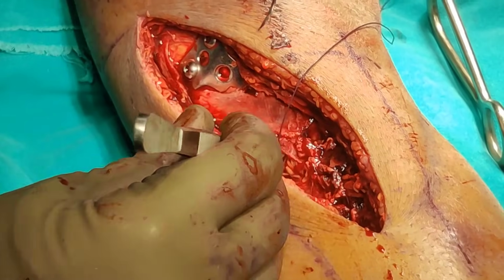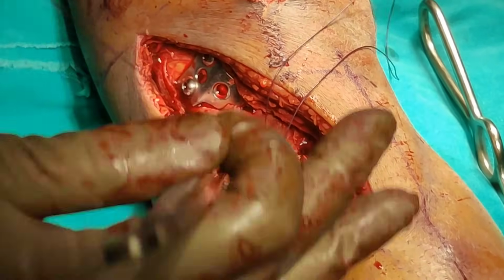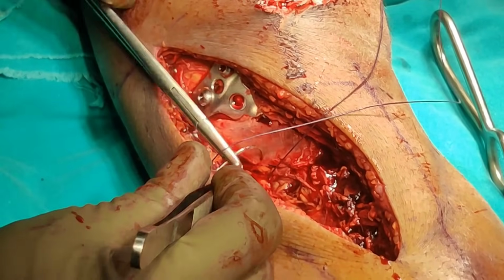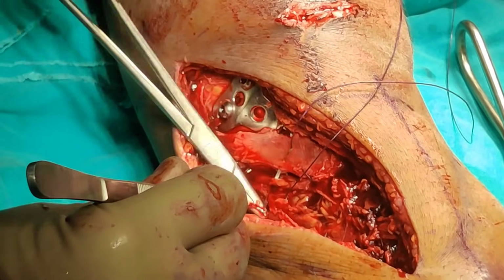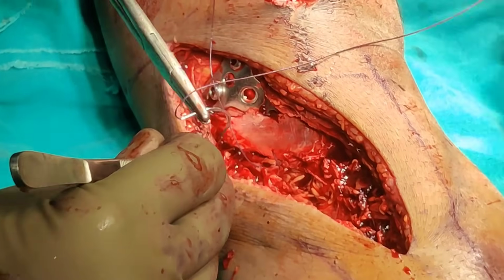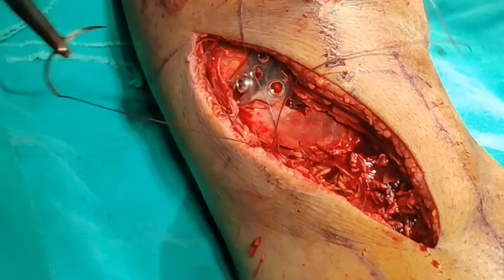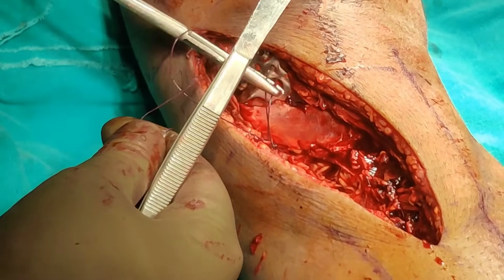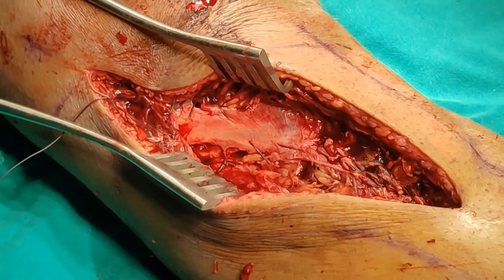So if you can see here, I have beautifully closed it. Can you see it now? The plate is nicely closed, and if you at all manage to accidentally cut the pes, or it's coming in your way and you're getting frustrated, you can cut it, but in the end you need to repair it. If some gentleman can use a Langenbeck and show me the apex, that will be great. So this is what I wanted to show actually. Once you have done it, it's pretty straightforward. So let me do this closure, and then I will show you how it looks. So whatever we cut, we have recreated it back.